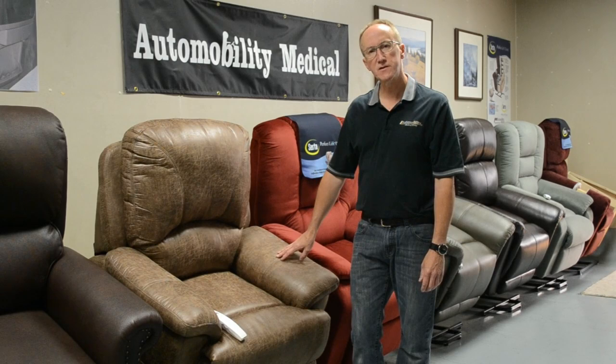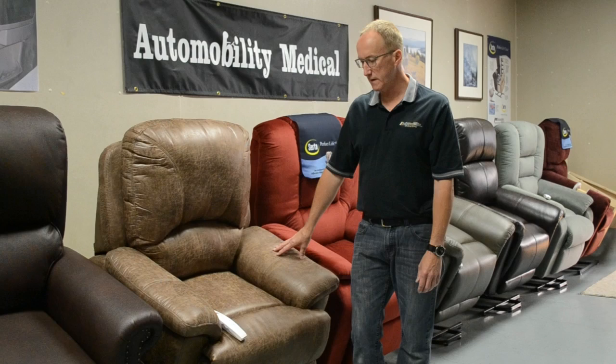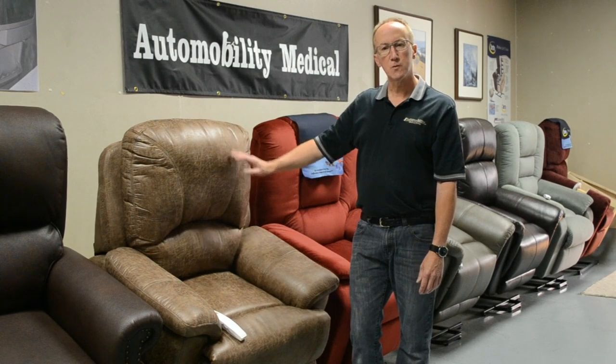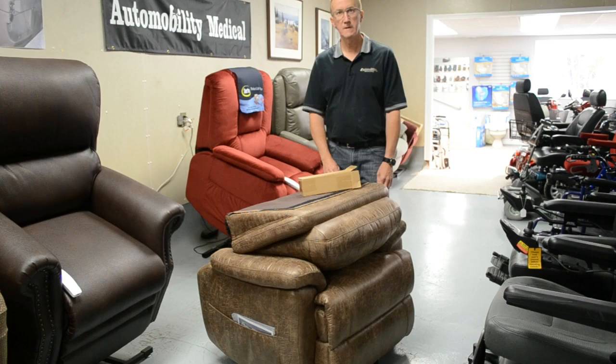Hi, my name is Jerry from Automobility Medical and we're the Canadian distributor for Certa lift chairs. We're going to show you a brief video of just how to set these chairs up when they come in to you. They'll be shipped in a big box but it's very simple to put together and set in place. The base is fairly heavy but the back is very light, so once you get your chair close to where you want it, it's simple to put together.